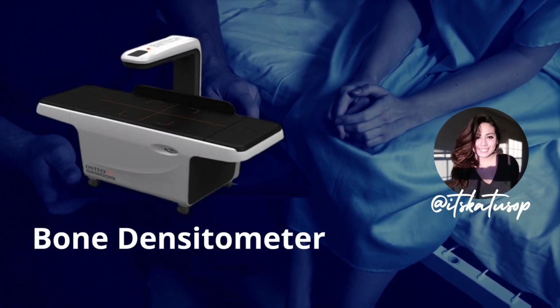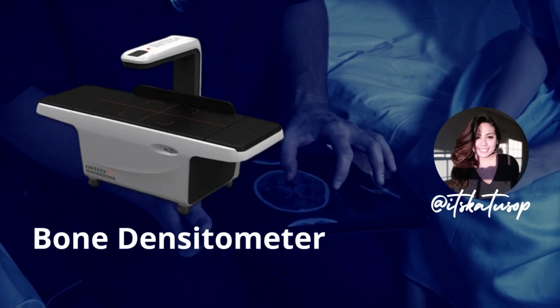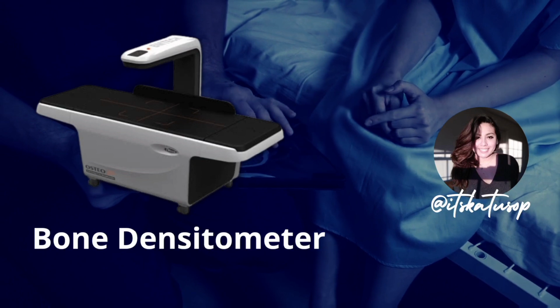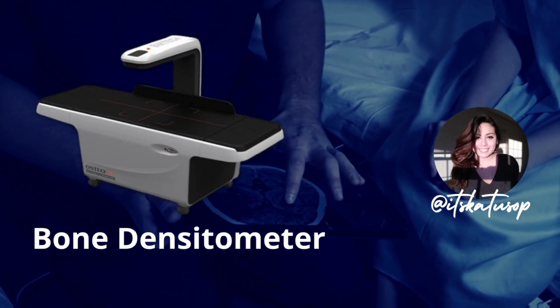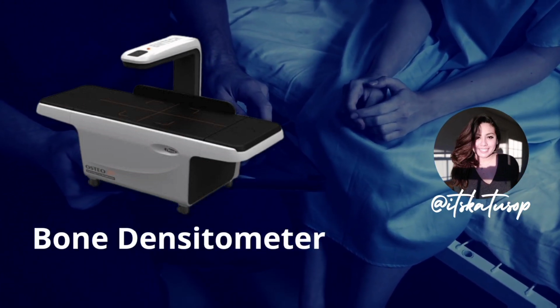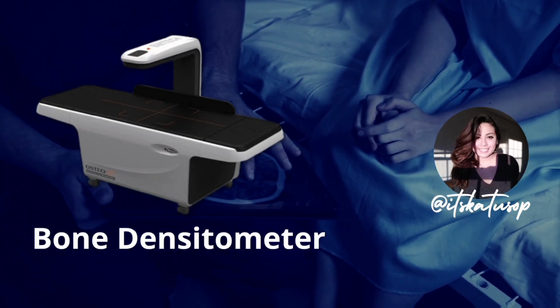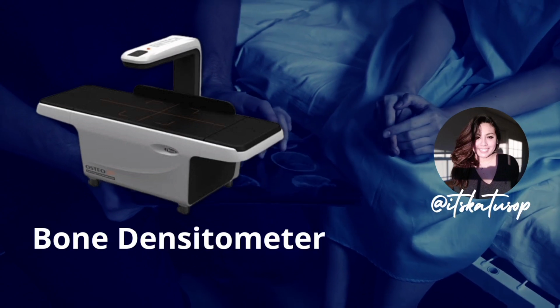Some of the emerging features to advance the technology of bone densitometers are high-resolution imaging, QCT, which stands for quantitative computed tomography, peripheral densitometry, 3D imaging, lower radiation dose, and also portability, so compact and movable. And of course, we should honorably mention artificial intelligence, AI enabled by advanced algorithms. I'll expand more on this in other videos.